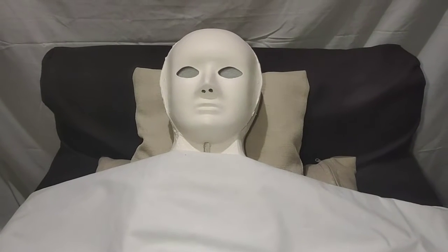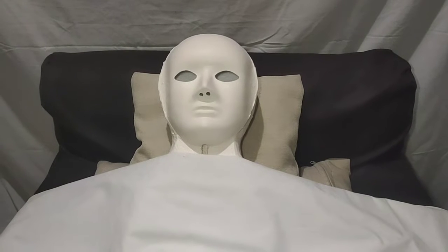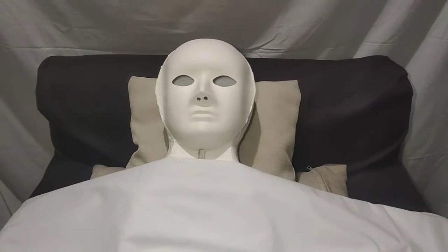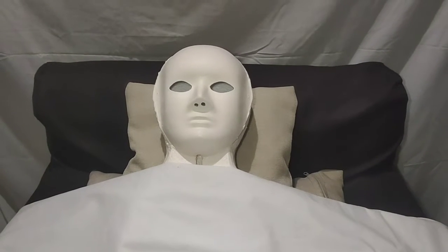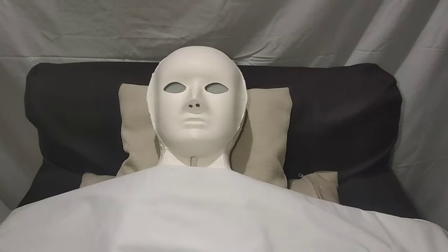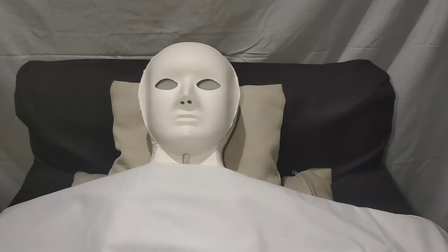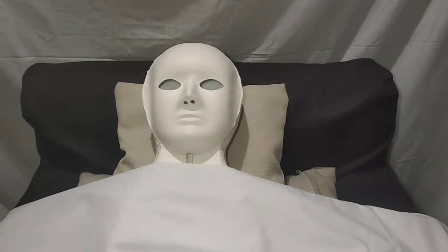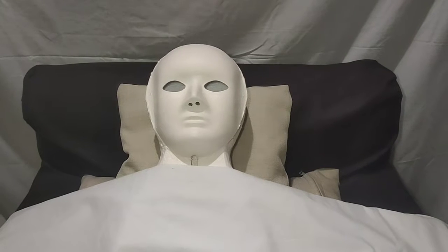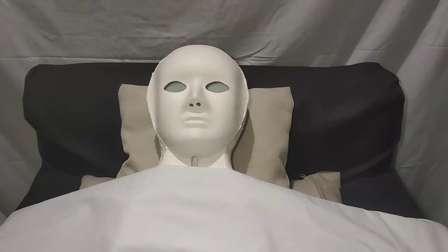Next is to assess the patient's history for any facial trauma, polyps, blockage, or surgeries. The patient's medical history has no facial trauma, polyps, blockage, or surgeries. The rationale for doing this is that patients with facial fractures or facial surgeries present a higher risk for misplacement of the tube into the brain. Many institutions require a physician or advanced professional to place nasogastric tubes in these patients.